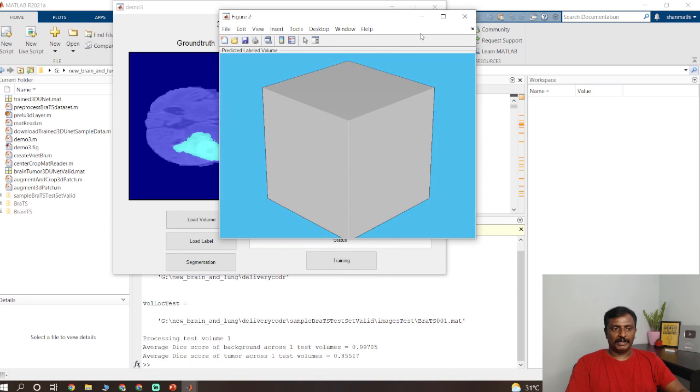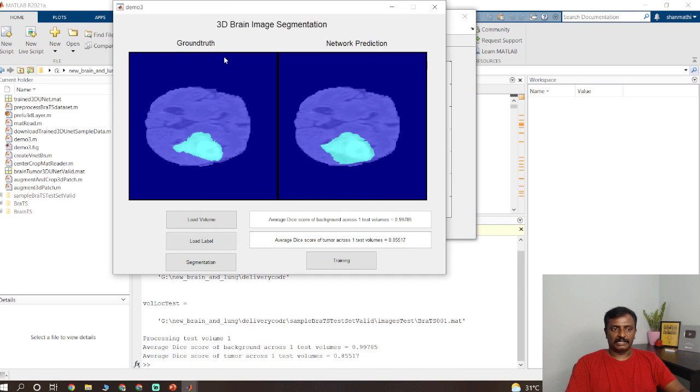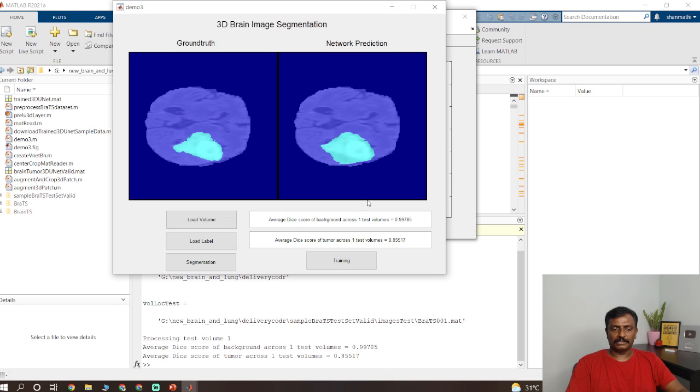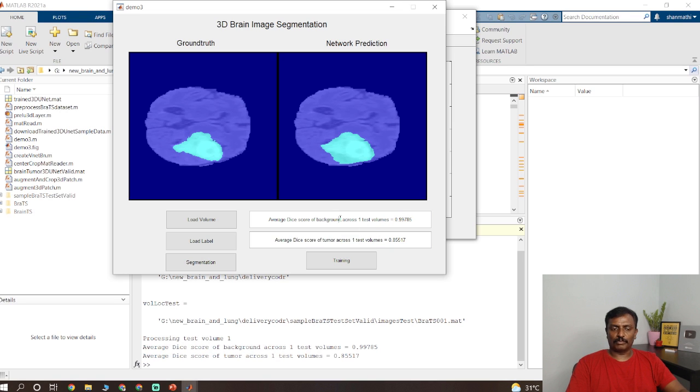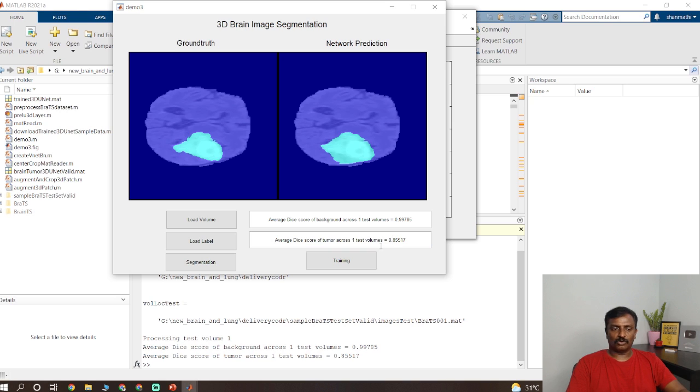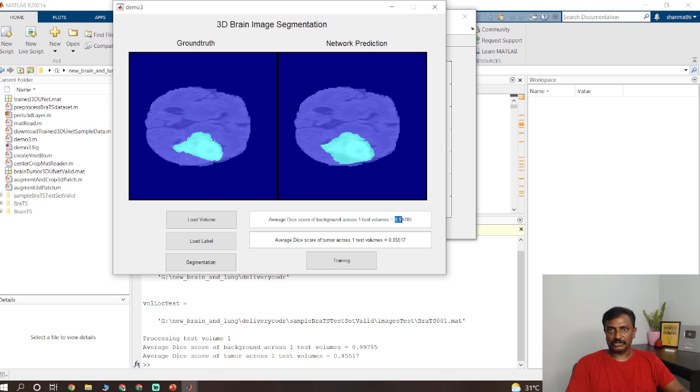So the output is displayed on the status bar. You have the ground truth output and the network predicted output. So it has the accuracy for volumes and tumor. This is for background. So it has 85 percent accuracy for identifying the tumor whereas for the background it has 99 percent accuracy.